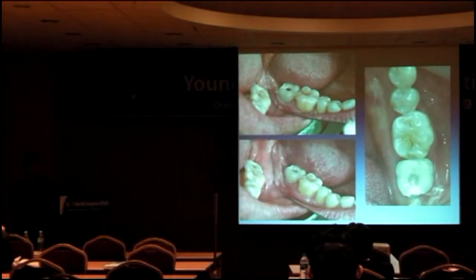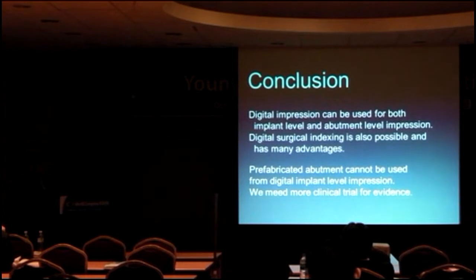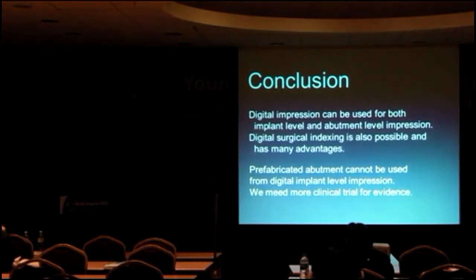case. So in this case, I made the digital impression and the surgical indexing at the time of implant placement. Three months later, without any procedure, I could just finish the treatment, because during those three months I could make the final restoration and customize the abutment using the data. So this is the conclusion I came up with.